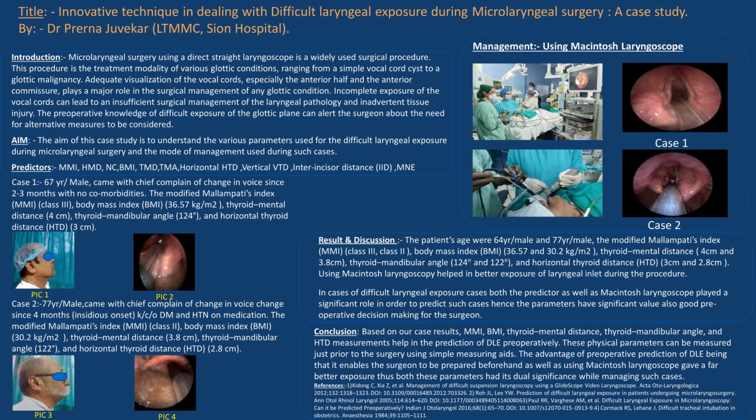Result: using Macintosh laryngoscope helped in better exposure of laryngeal inlet during the procedure. Discussion. In cases of difficult laryngeal exposure, both predictors as well as Macintosh laryngoscope played a significant role to predict such cases. Hence, the parameters have significant value, also good operative decision making for the surgeon.